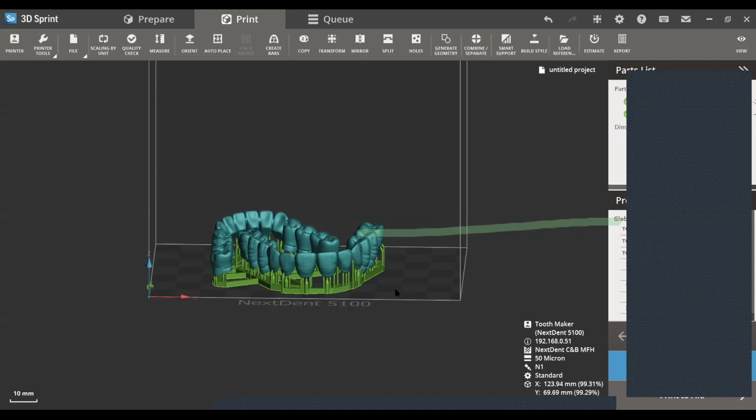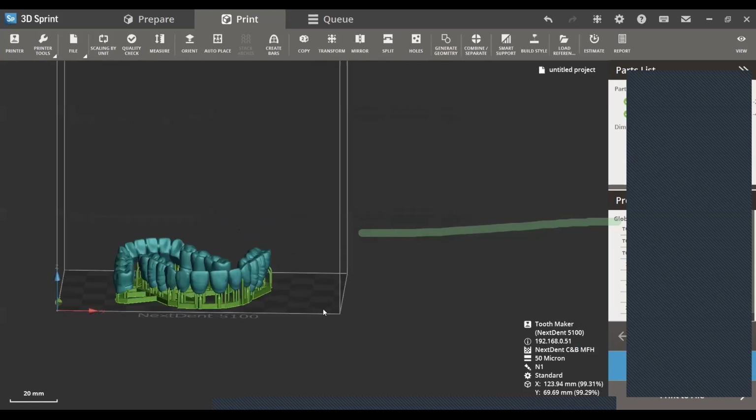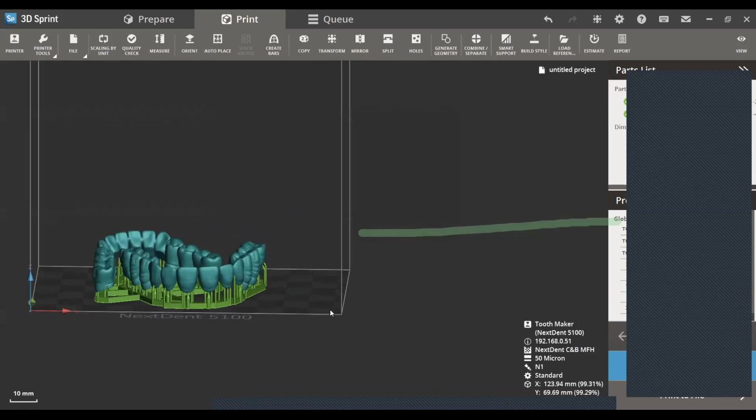And then our friend Kyle is wondering, when are we getting the new Sprint update? So maybe he's looking forward to some of the stacking functions and stuff like that. Yes, the new Sprint update will be out this month. We are just finishing up our gate reviews on it and our reliability testing. I am going to show you a couple of new things from the new software that's coming out, so you guys will be prepared. But I would say within 2 weeks, we have our last gate review tomorrow on it to make sure it passed all of the reliability testing.